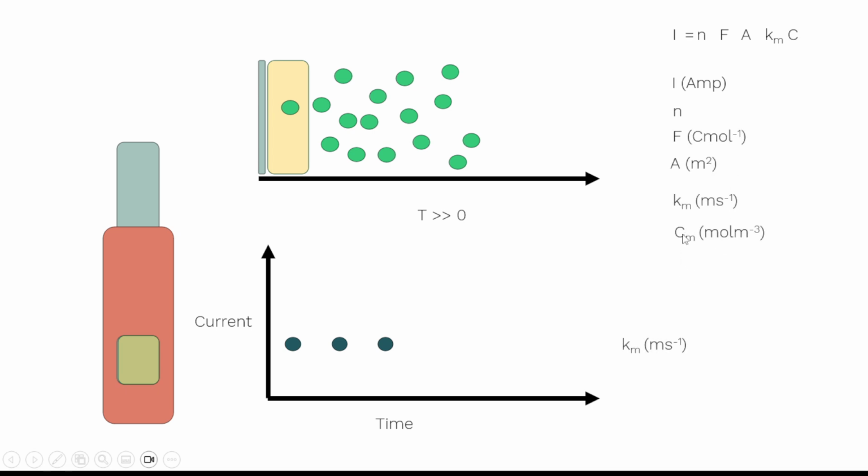I've made a mistake here, by the way. I put that as Cm, I should have just put it as C. But understand now that mass transport, that term earlier on that I kind of called a velocity, or I wasn't sure whether to call it a velocity or a speed, actually means something a little bit different this time. It actually means the effective diffusion of the electrochemically active molecules through that membrane divided by the thickness of that membrane. So that's the thickness here.